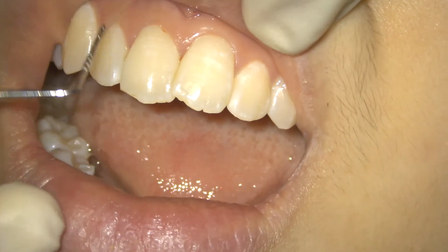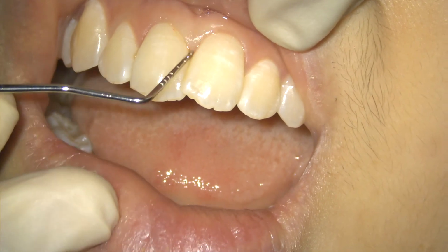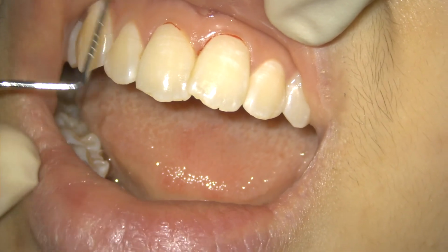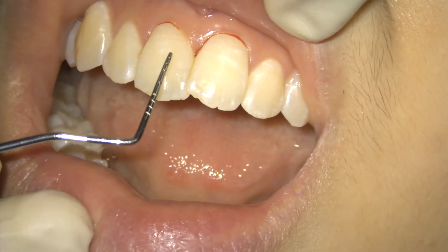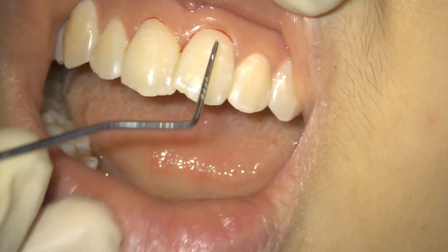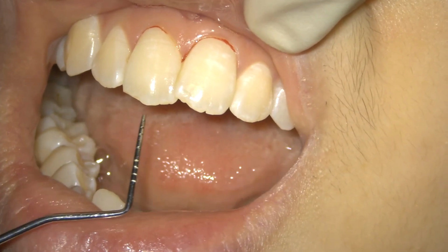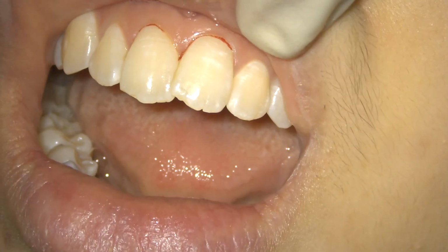Once you probe and run the probe along the gingival sulcus 1 mm like this, then you assess the probing. As you can see here, what is the score for this particular tooth? If you observe, here is 0, here is 1 because bleeding is seen, here is 0. Whereas for tooth 2-1, it is 1, 1 and again 0. So this is how you score on the 3 sides. Palatally we didn't probe, so I am not checking. Otherwise, for completion of the tooth, you also have to verify palatally. I hope it's clear.